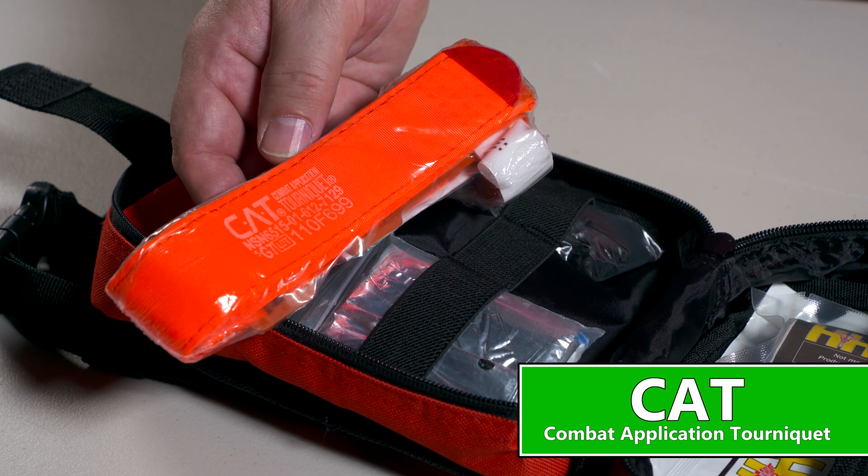Applying a tourniquet correctly is simple to learn, and anyone can do it. Let's look at the four basic steps to applying a windlass-style tourniquet, like the combat application tourniquet, or CAT, shown here.